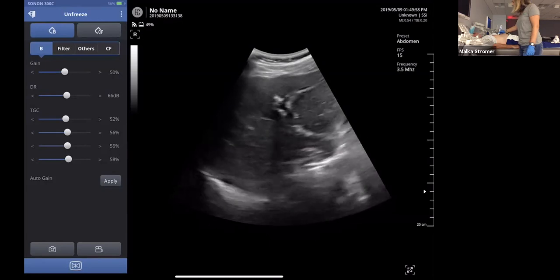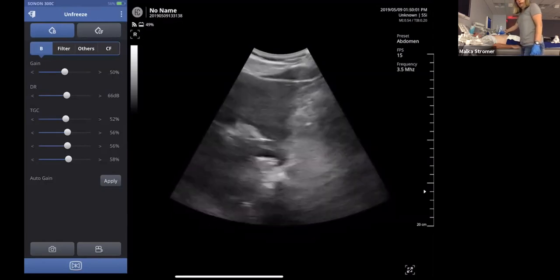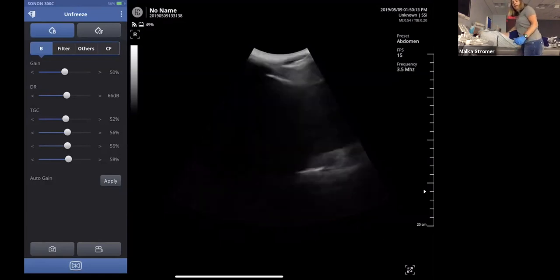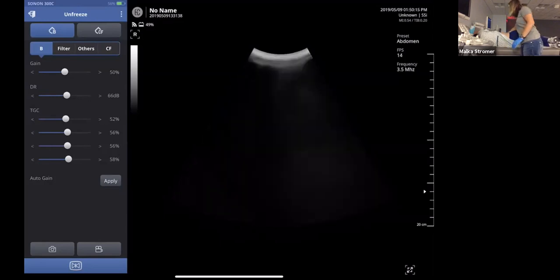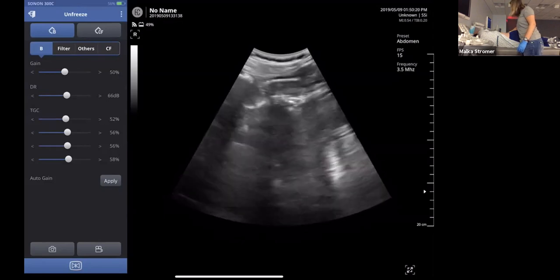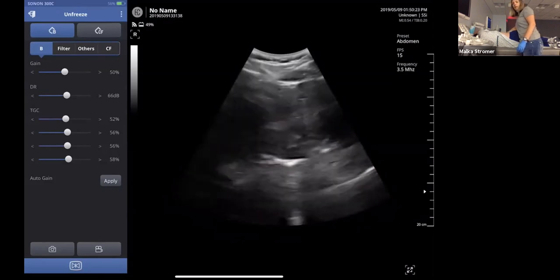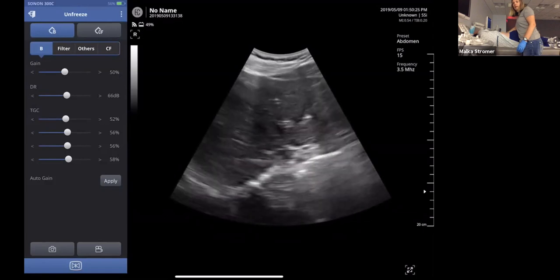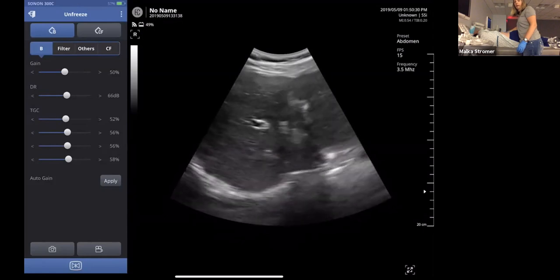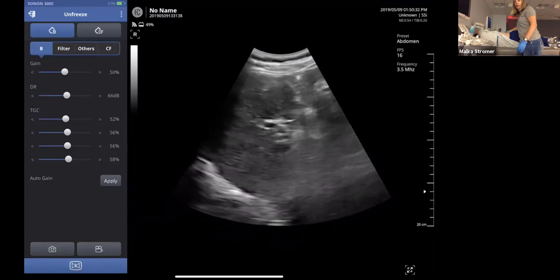Breathe normally. Okay. What I'm going to ask the patient to do now is actually turn over onto their left-hand side. And what this will do is allow us to optimize our window by having the liver fall down over the anatomy that we're taking a look at. So we're going to start again. Deep breath in, hold. Okay, so we're up really high. We can see hepatic veins, left portal vein, coming down a bit to the right, and there is the right portal vein coming across the screen there.